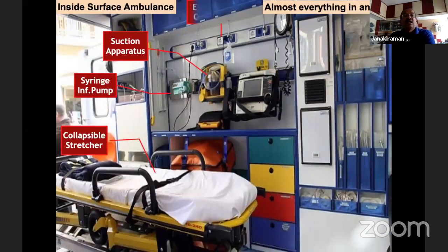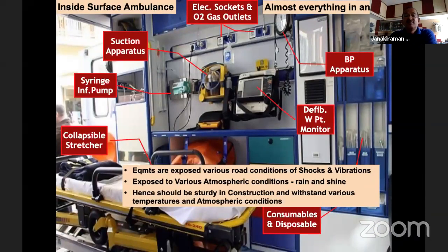Look at this. This is an ambulance inside. You have got almost everything in an ICU. You got a defibrillator, you got a monitor, suction apparatus, syringe pumps, collapsible stretcher. These equipments are exposed to various road conditions. These equipments have to have a certification of shocks and vibrations because they are not ICU equipment.